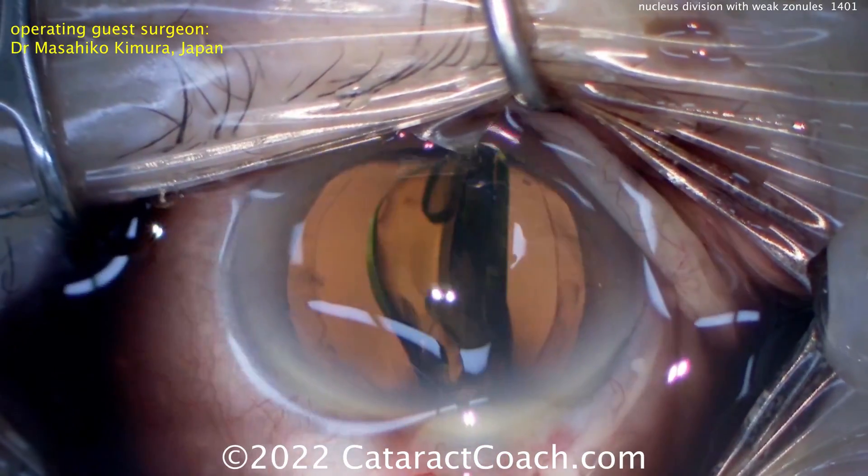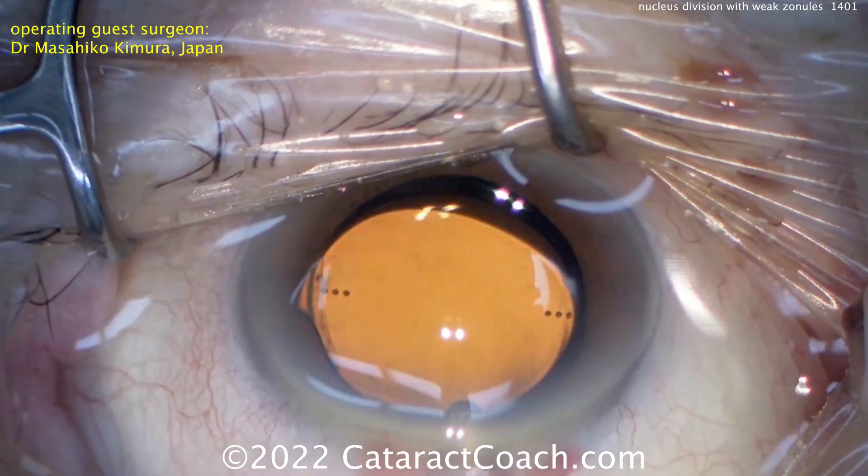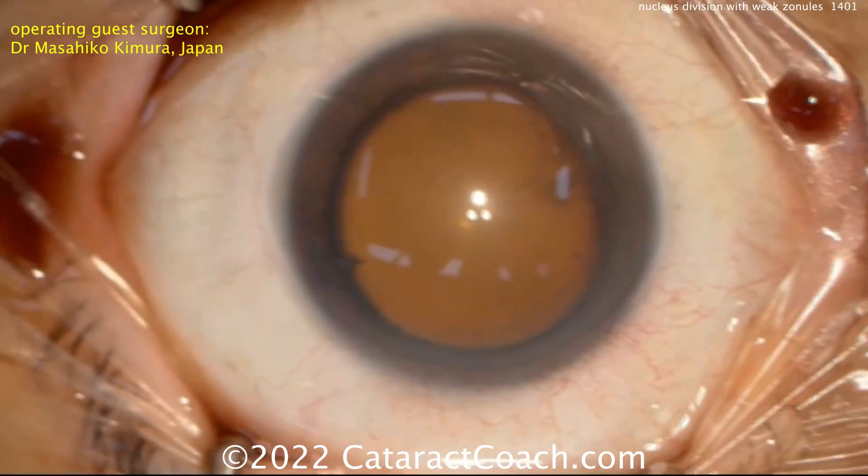So one good idea here: splitting the nucleus into multiple small strips. Now Dr. Kimura also has another tip for us. Let's watch.